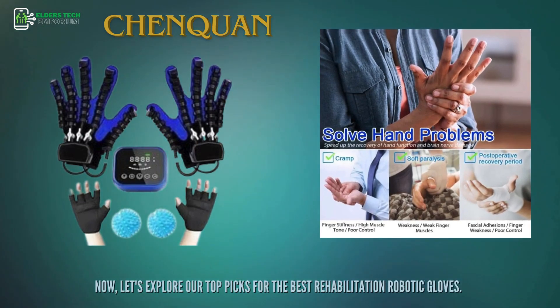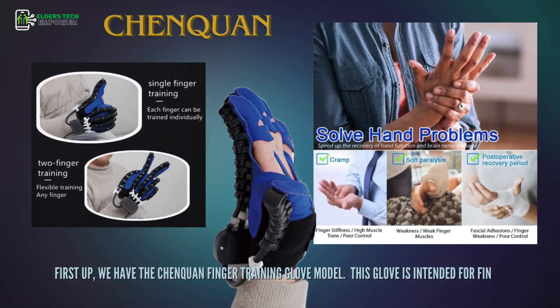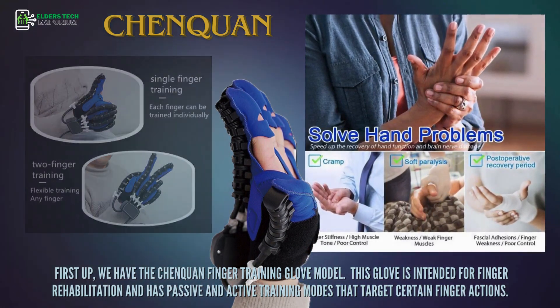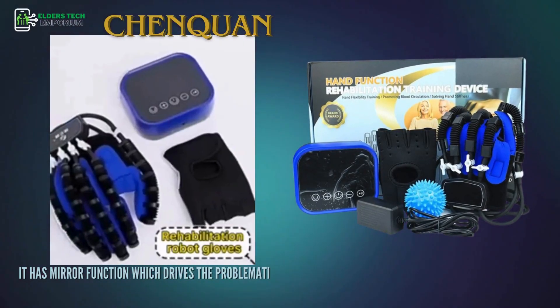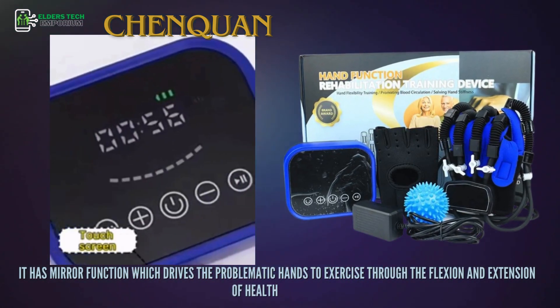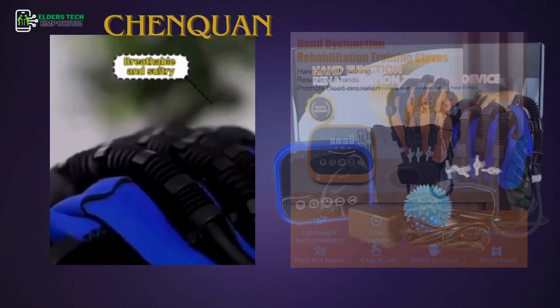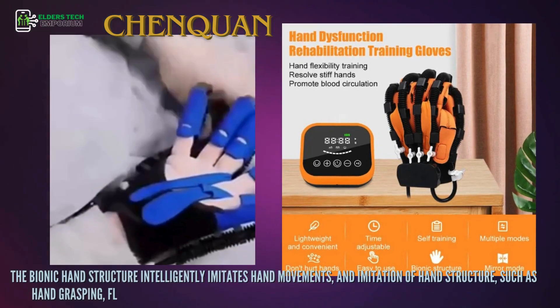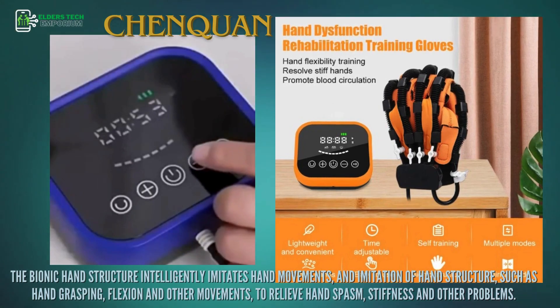First up, we have the Chenquan Finger Training Glove model. This glove is intended for finger rehabilitation and has passive and active training modes that target certain finger actions. It has a mirror function, which drives the problematic hands to exercise through the flexion and extension of healthy fingers. The bionic hand structure intelligently imitates hand movements — such as hand grasping, flexion, and other movements — to relieve hand spasm, stiffness, and other problems.